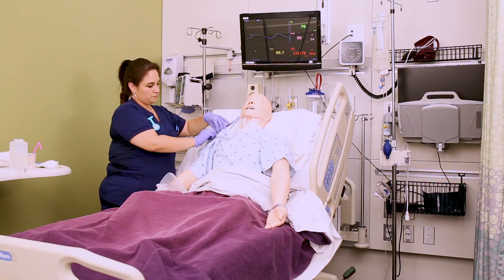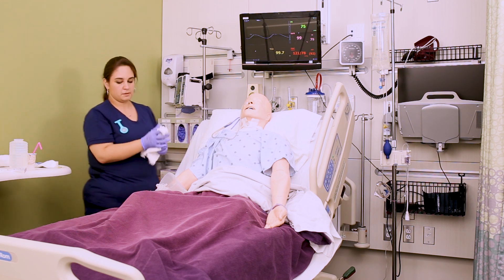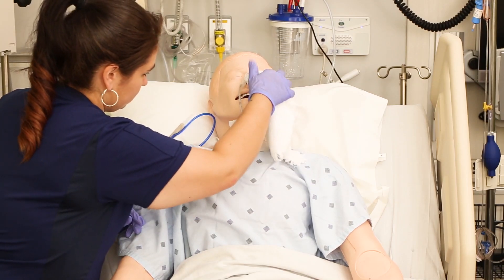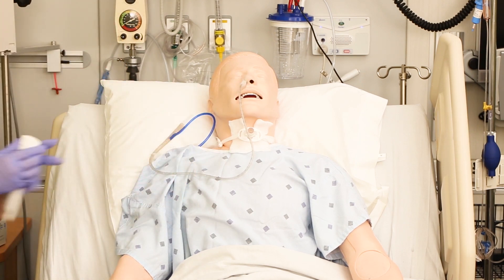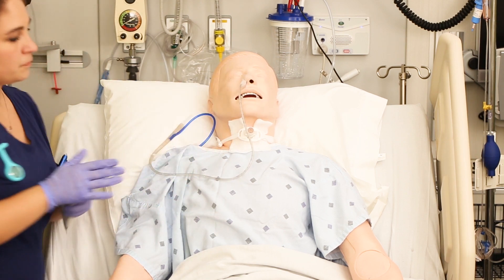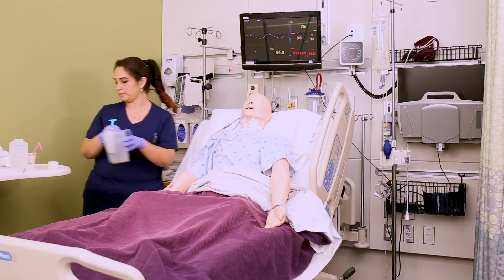The last thing we want to do every shift for these patients is oral and nasal care. That includes letting the patient brush their teeth if they're able, or you brushing their teeth and using mouthwash. We also want to use a warm washcloth to wash around the nares and assess closely for any kind of skin breakdown. We'll usually apply a lubricant jelly around the tube as well, because these hard tubes can really cause pressure ulcers.